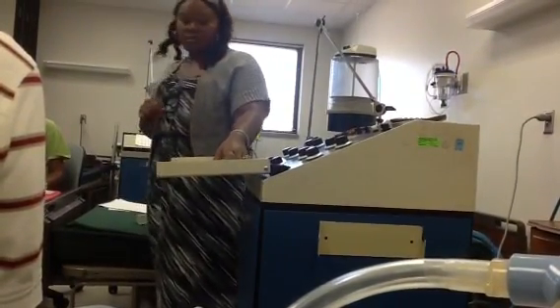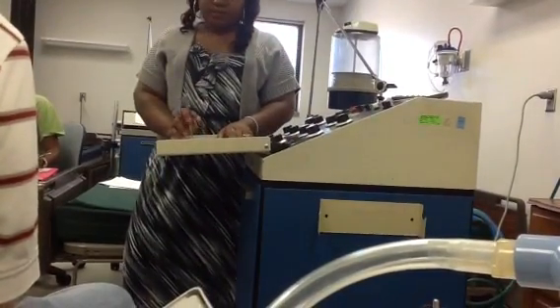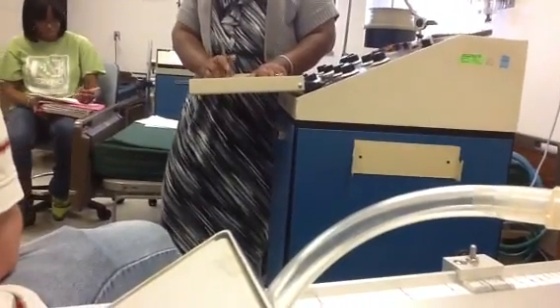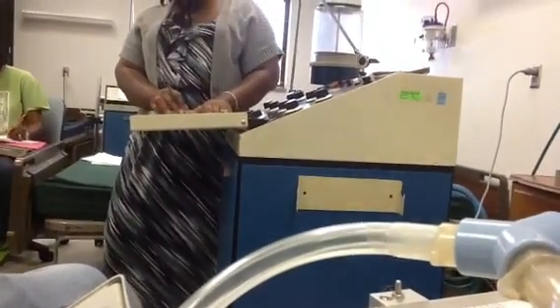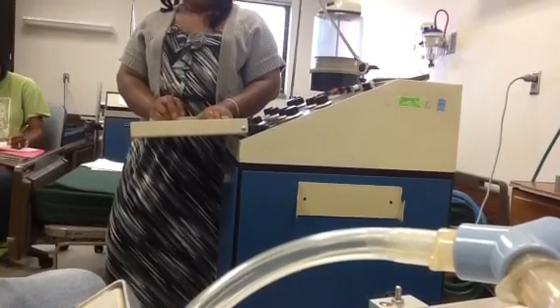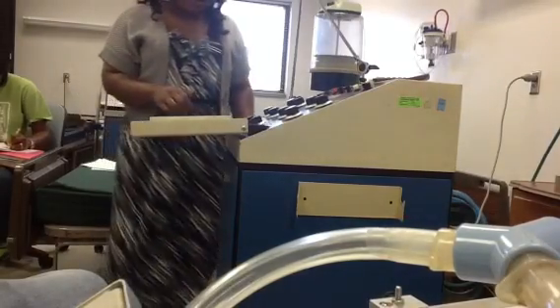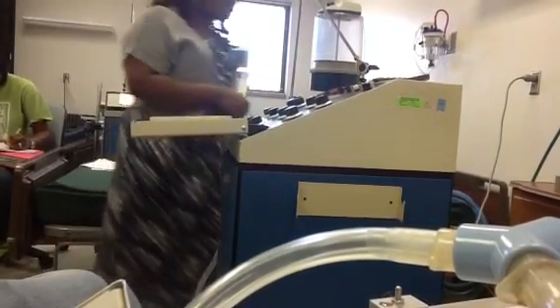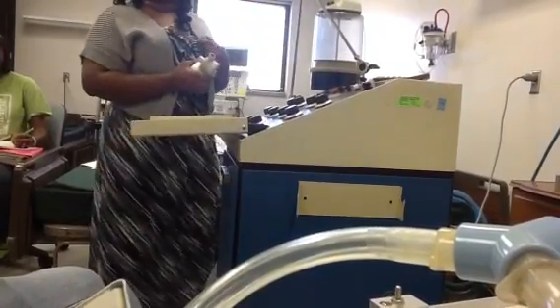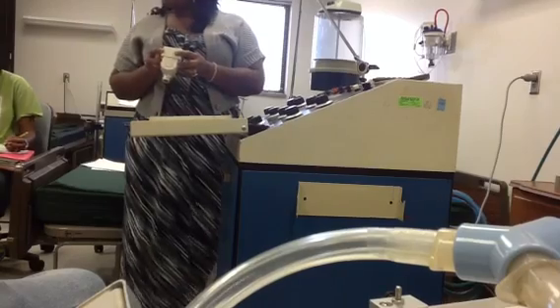Sigh volume. We calculated sigh volume. 1.1 liters. Yep. That was when we multiplied the 0.55 times 2. Measure tidal volume next. Yes. So measure tidal volume. You actually need to measure your tidal volume. Wait, what was sigh tidal volume? Oh, no, never mind. Calculate. It's the tidal volume times 2. You need to measure your tidal volume.